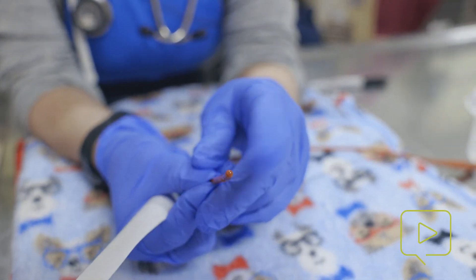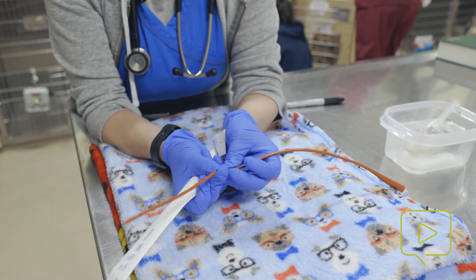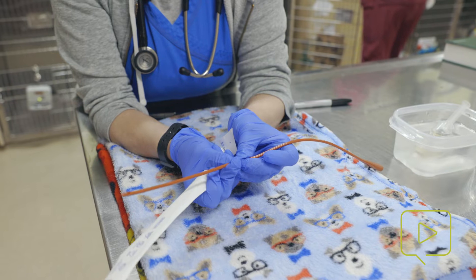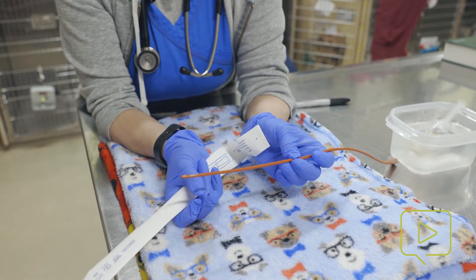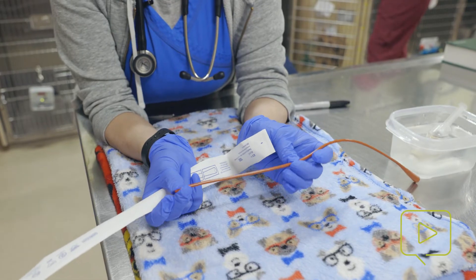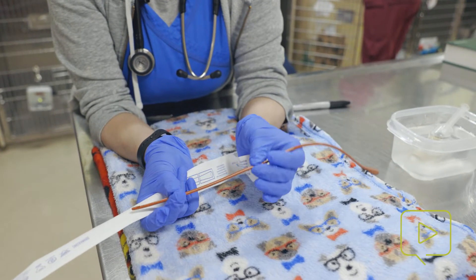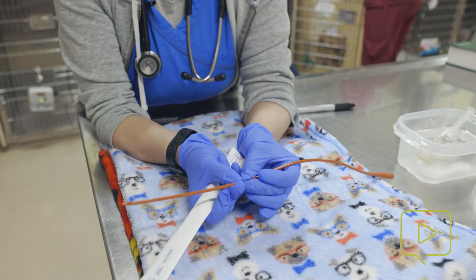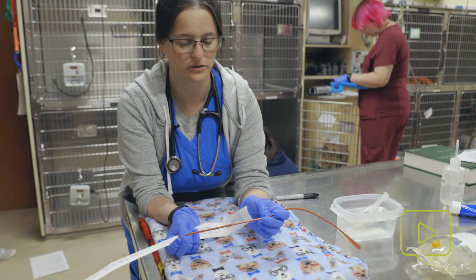It's okay to leave the tube long, but we're going to measure and mark the appropriate distance from the mouth to the stomach so that you can use that as a marker for when you're introducing. You wouldn't be able to get beyond the lungs. So if you can introduce your tube all the way to your marker easily, then you're more likely to be in the stomach rather than in the respiratory tract.